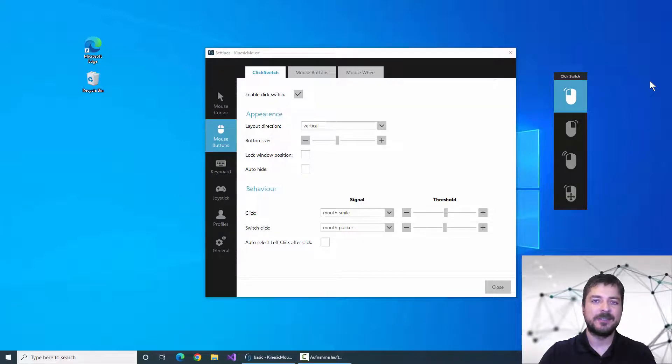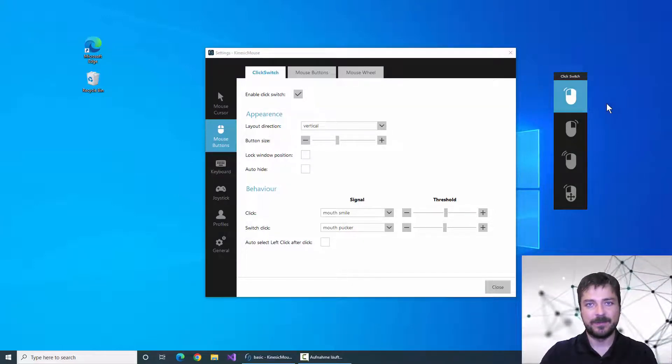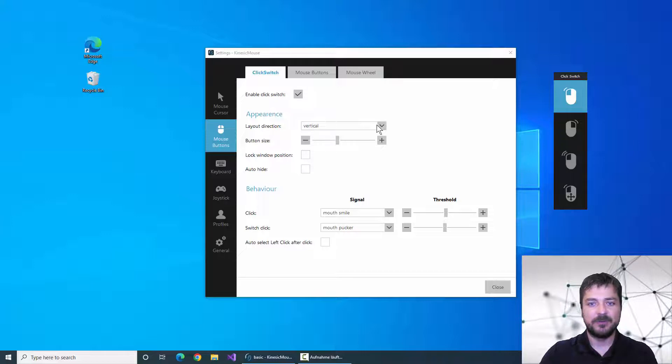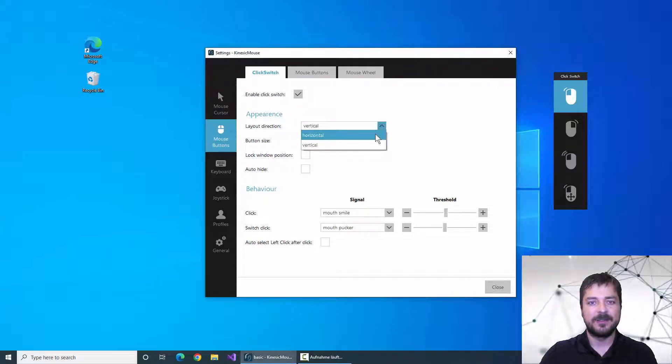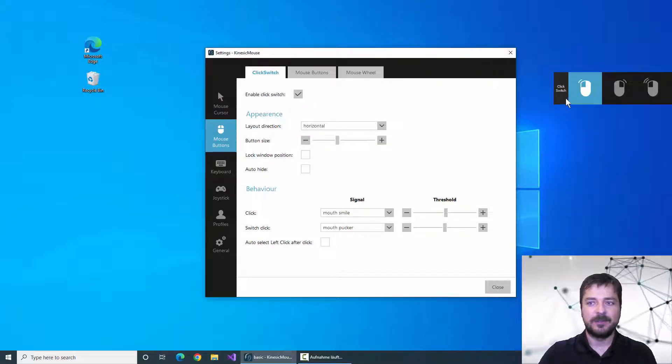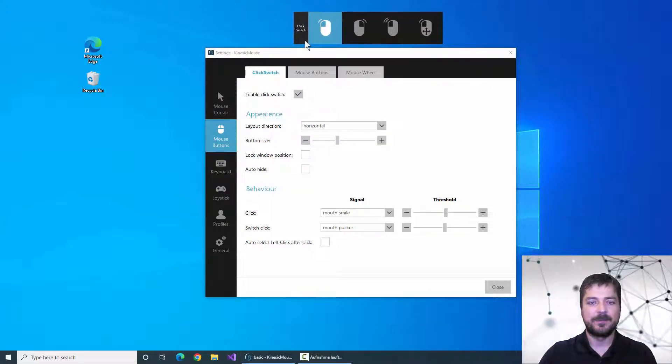The first thing we can adjust is the layout of the click switch buttons. You can choose between a vertical alignment and the horizontal alignment like this.